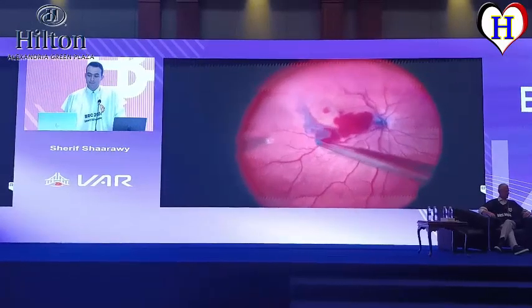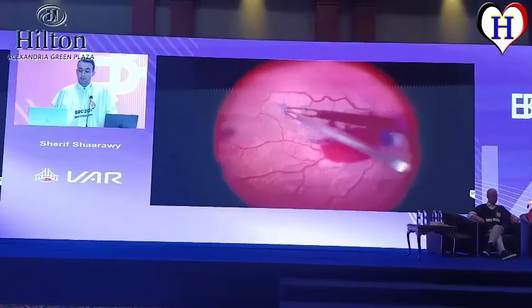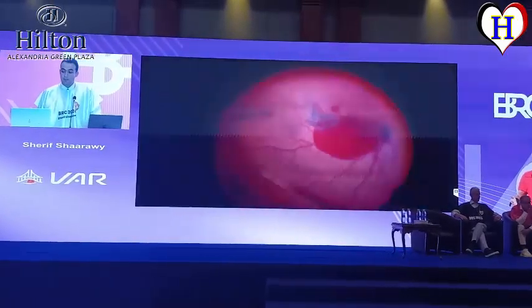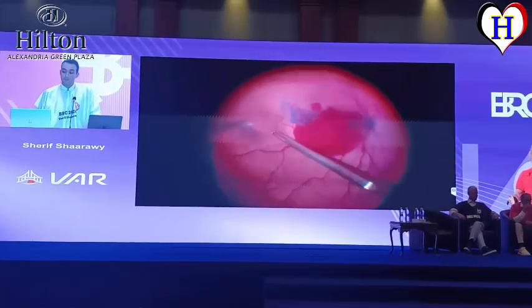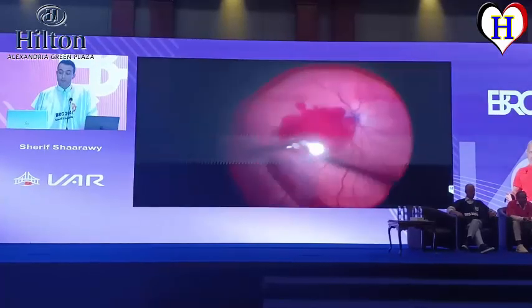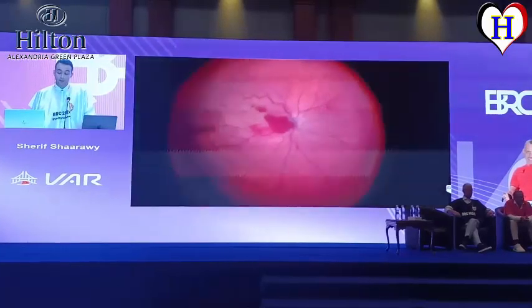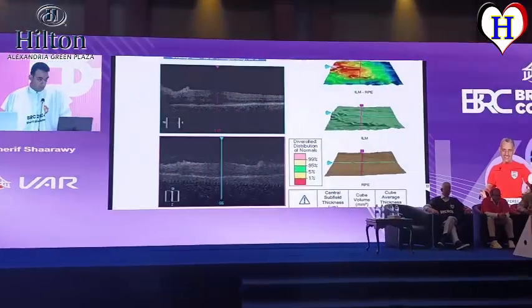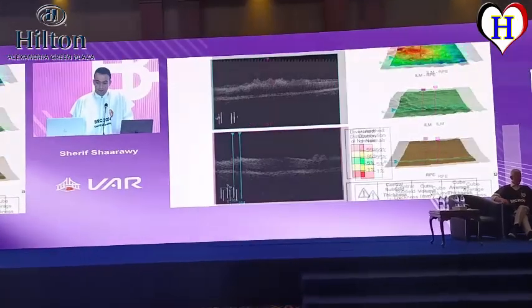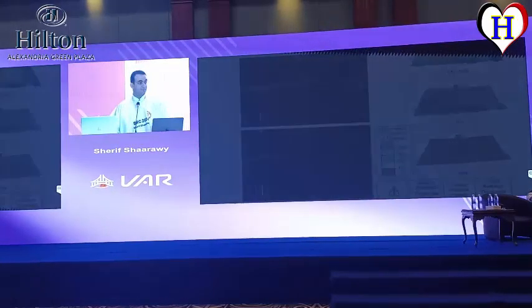So I concluded my peel. I removed all the membrane, including the ILM, and peeled the rest of the ILM. And then, as you can see, I started to try to remove the blood, and that blood was very close to the retina. I decided not to remove the rest of the blood very close to the disc. And that was the post-operative appearance with the membrane removed. And still, the foveal contour is not back to normal. But yeah, that was my case.